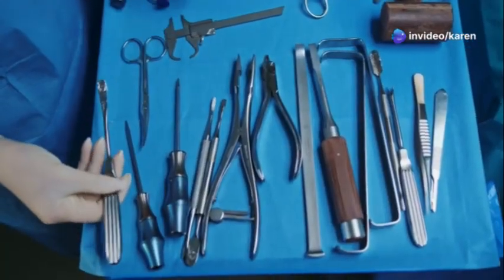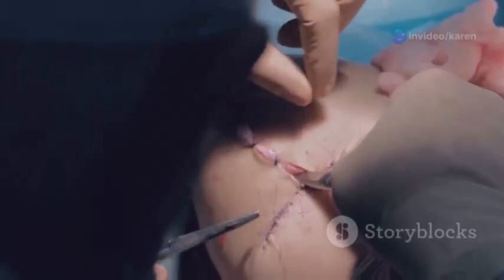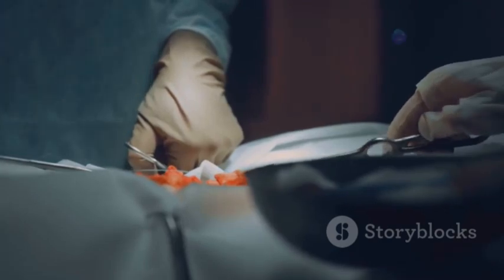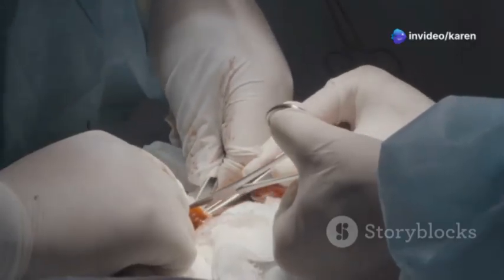The choice of suture and needle depends on the type of surgery. It also depends on the location of the wound. The surgeon's preference is also a factor. Proper suturing technique is crucial for optimal wound healing. It also minimizes scarring and prevents complications.